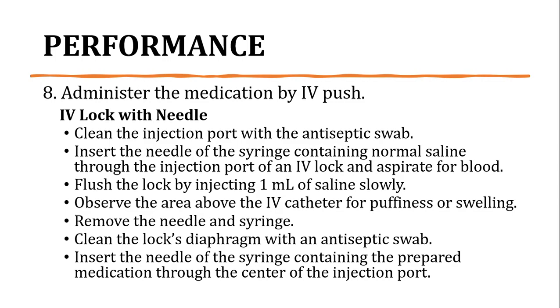Remove the needle and syringe. Clean the lock's diaphragm with an antiseptic swab. Again, every time na may bagong i-insert na syringe is kailangan i-clean yung diaphragm of the lock or injection port with an antiseptic swab para po maiwasan yung pag-introduce ng microorganisms sa vascular system ng client and to maintain the sterility of the procedure. Insert the needle of the syringe containing the prepared medication through the center of the injection port.